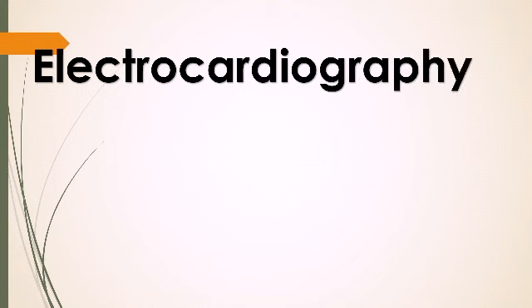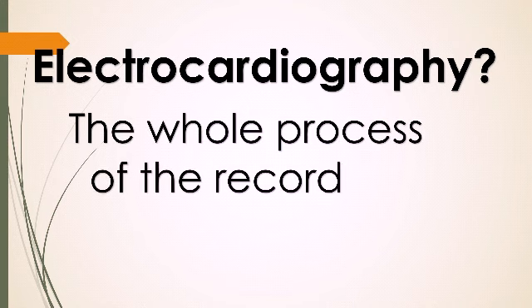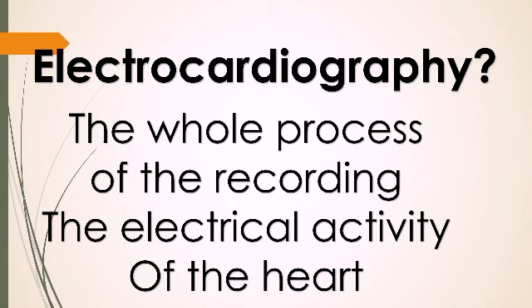Good. The third term is electrocardiography. You wonder, what is electrocardiography? You remember the first one was electrocardiograph, the second was electrocardiogram, and this third one is electrocardiography. So this is the whole process of recording the electrical activity of the heart. The whole process, taking the machine, using it to record the ECG, that is electrocardiography.